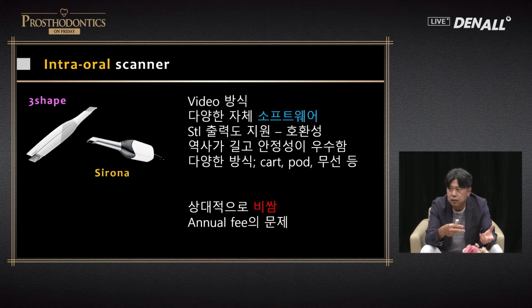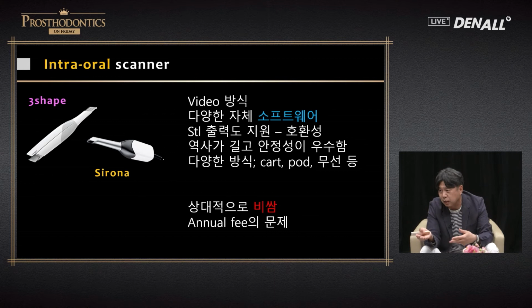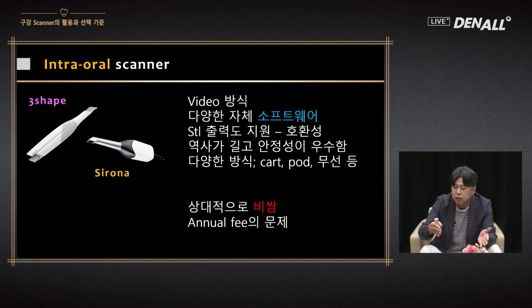Software as well as firmware need to be upgraded to enhance the performance of the device. In general, some companies don't charge annual fees, but they charge for the upgrades in many cases. So if you don't want to get upgraded, you can just use the old version. If you are paying the annual fee, the firmware is always up to date, whether you want it or not. So maybe they are the same.